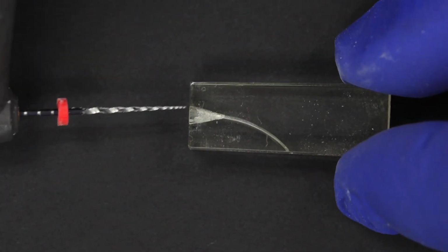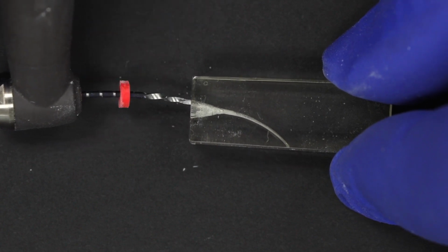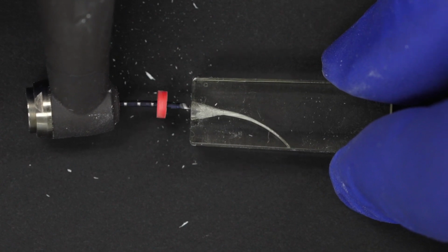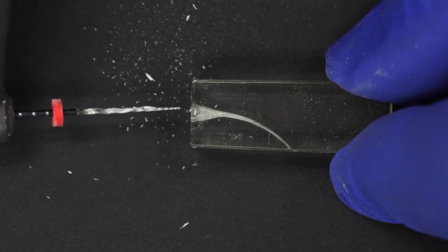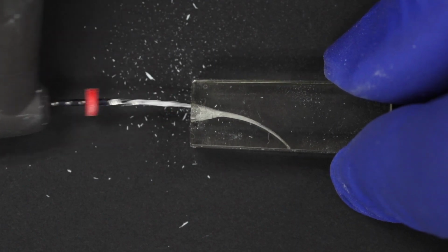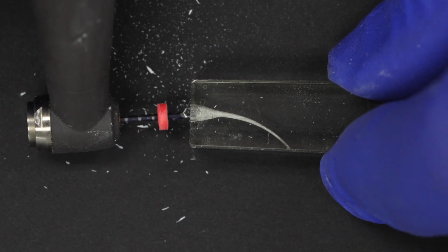Brushing motion. Go in, as you come out, you brush. Go in, come out, you brush. You can also brush on the internal part of the curve in your canal.